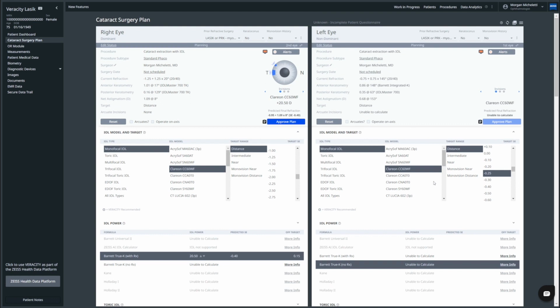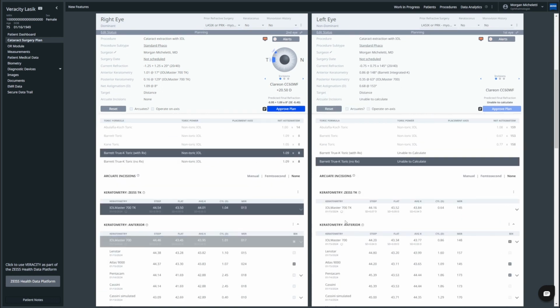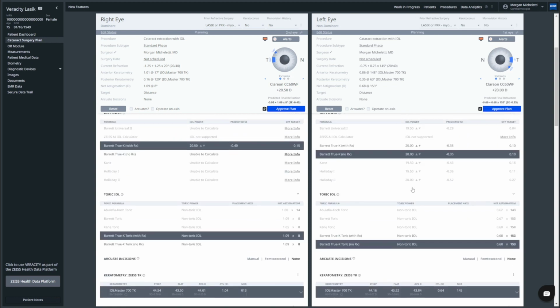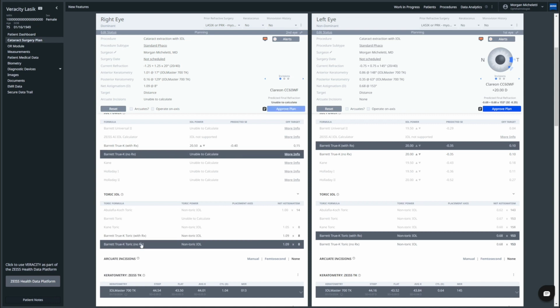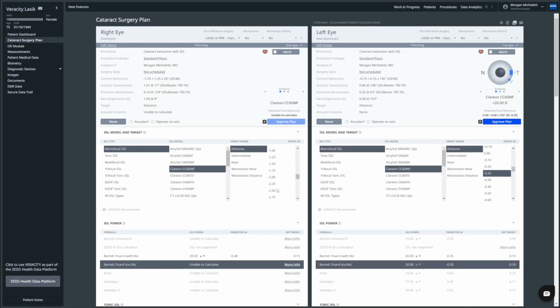Let's see if it doesn't access it with the font. Okay. So let's go ahead and choose our TKs here. There we go. And again, like I said, I typically use my no RX for the most part. So just go here. And our target chosen.